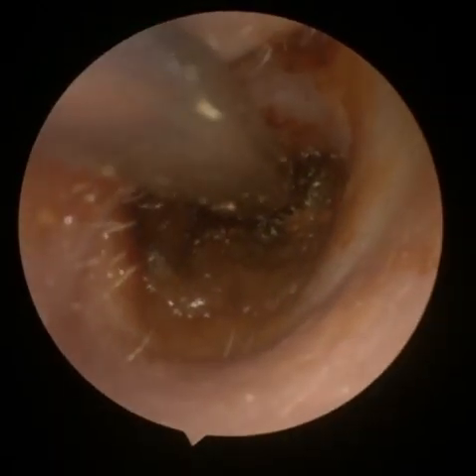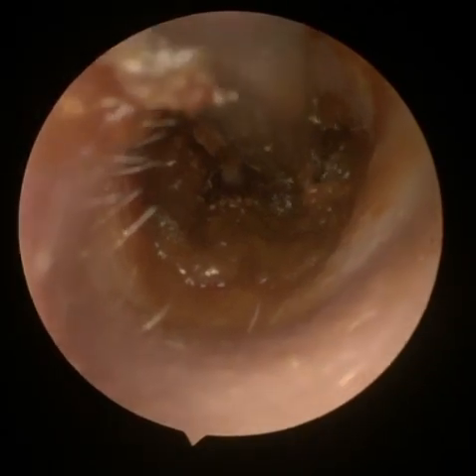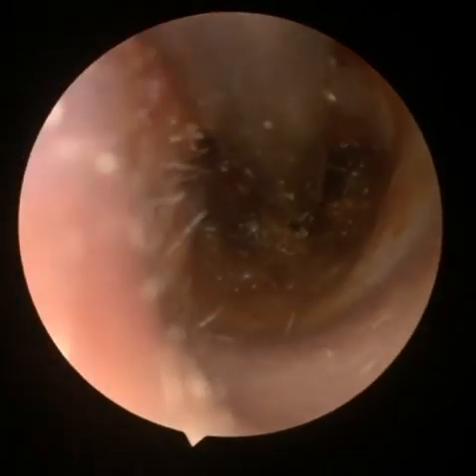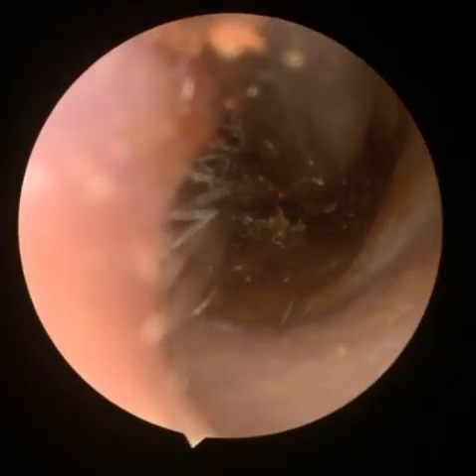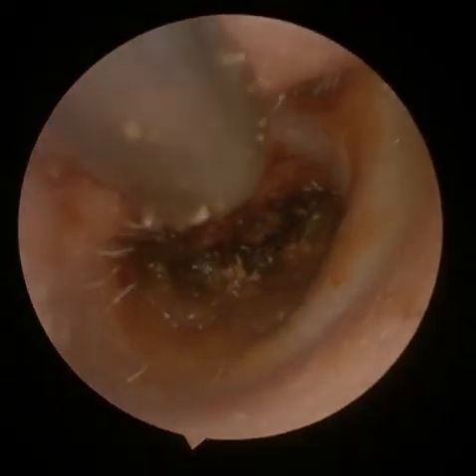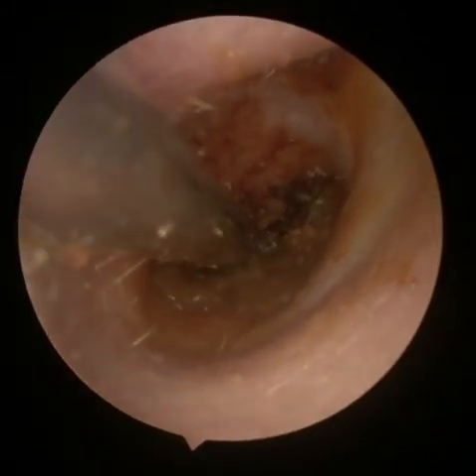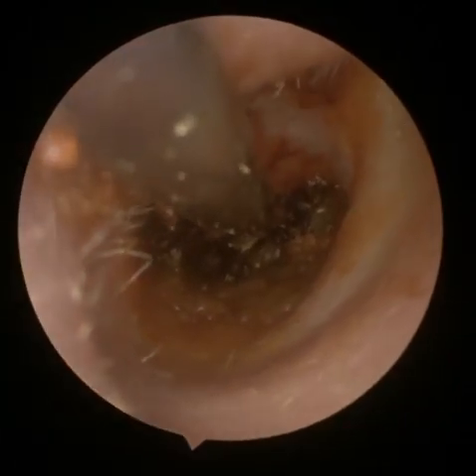Here we go — as we enter, always trying to find just that corner which will allow you to remove the greatest amount of wax. Attacking the canal walls is always the best way of removing that deeply impacted wax. In a second you'll start to see the first part of that drum just being exposed.